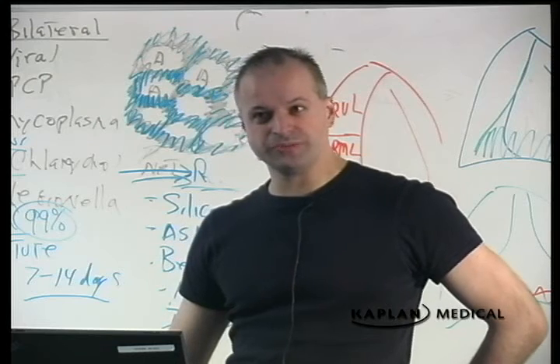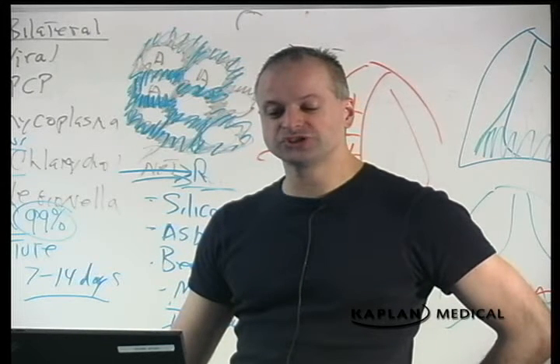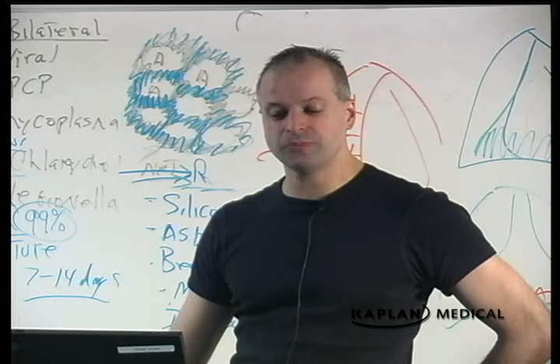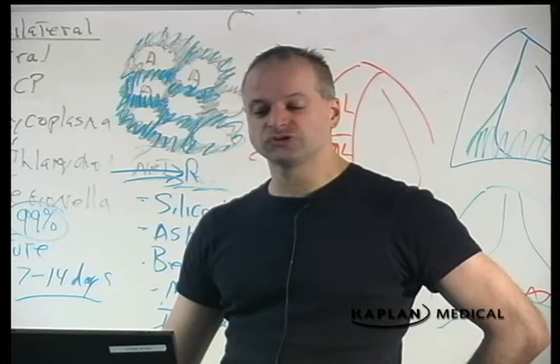These are the stretched out posterior pharyngeal constrictor muscles. The management of this is surgery, to surgically resect that Zenker's. These are the posterior pharyngeal constrictor muscles as they're outpocketed backwards in the pharynx. The management of this is not to put a nasogastric tube in it, not to put a scope in there. If you put nasogastric tubes and scopes, the nasogastric tube and scope might go into that Zenker's and pop right out the back of it and rupture it.